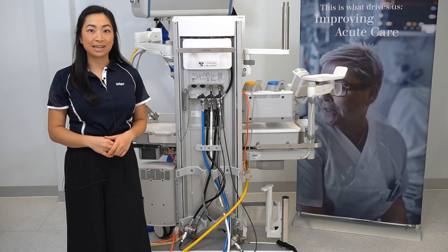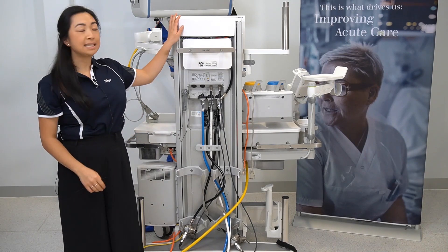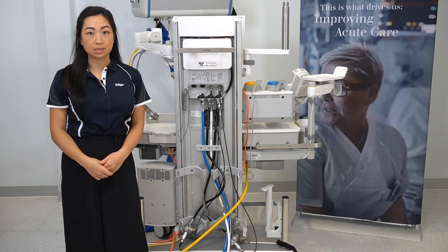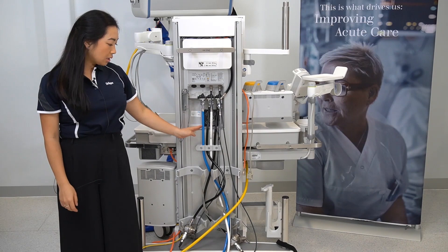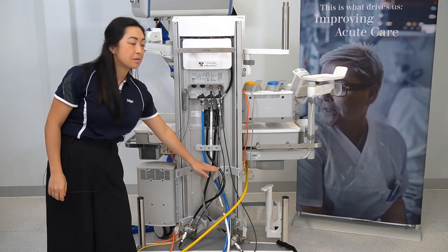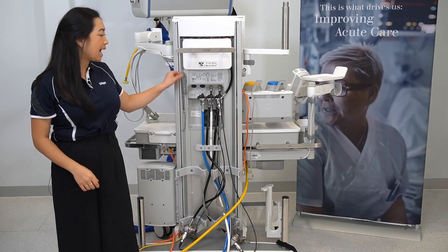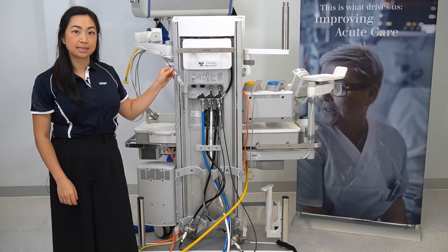Now we are looking at the back of the Perseus A500. Underneath this cover are additional power sockets. These hoses will connect to your central gas supply system, and here you can mount your reserve gas cylinders. Also attached is a wrench to open certain cylinders.